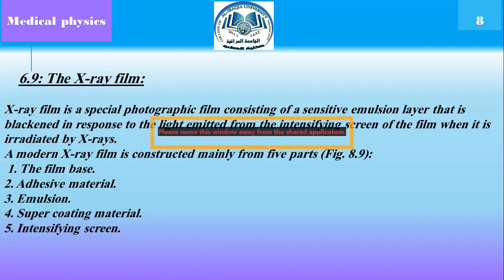1. The film base. 2. Adhesive material. 3. Emulsion. 4. Super coating material. And 5. Intensifying screen.